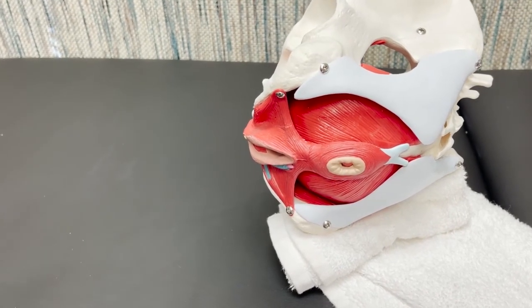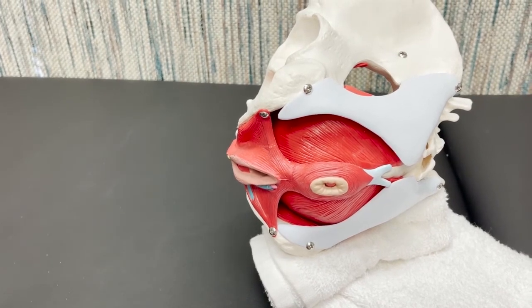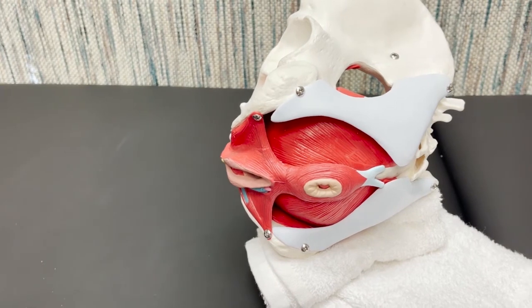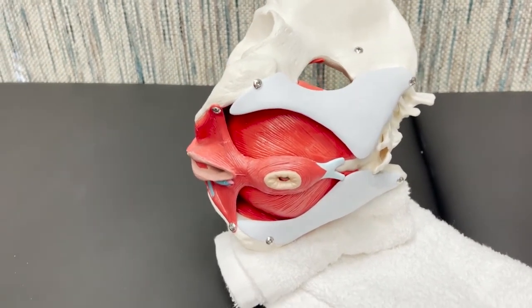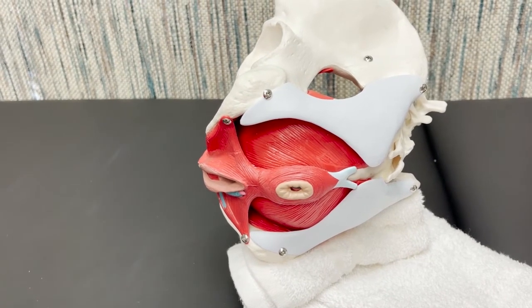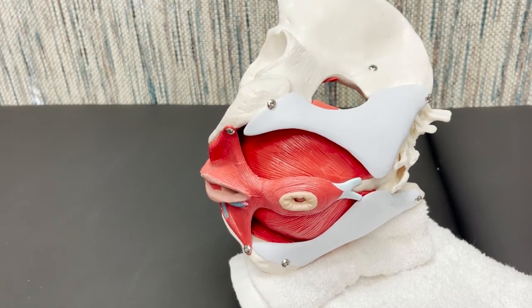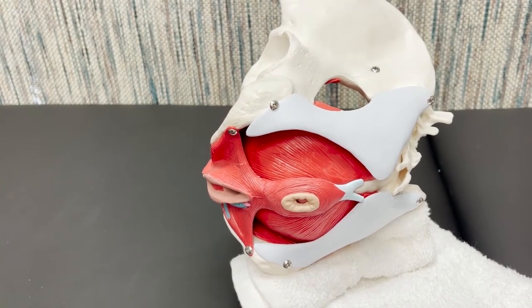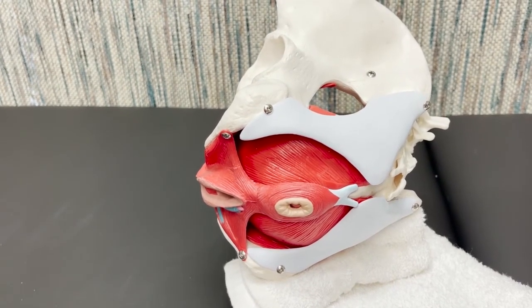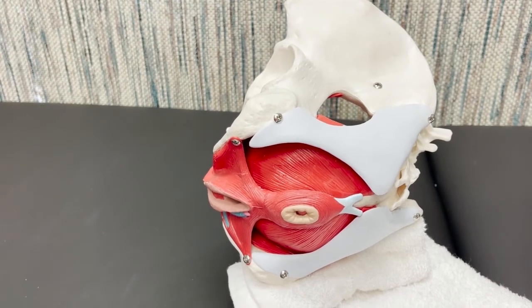So here is a modification of our dry needling treatment of obturator internus. This will be more into the bulk of the muscle belly of obturator internus, as opposed to the pelvic rotator cuff, where we needled the smaller musculotendinous junction as it attaches onto the femur itself. Our position will be side lying. Our needle length will be about 40 millimeters. The backdrop is either none or down to the ischium itself. Again, precautions here are the rectum, the vaginal canal, the urethra, and the inferior rectal neurovascular bundle.